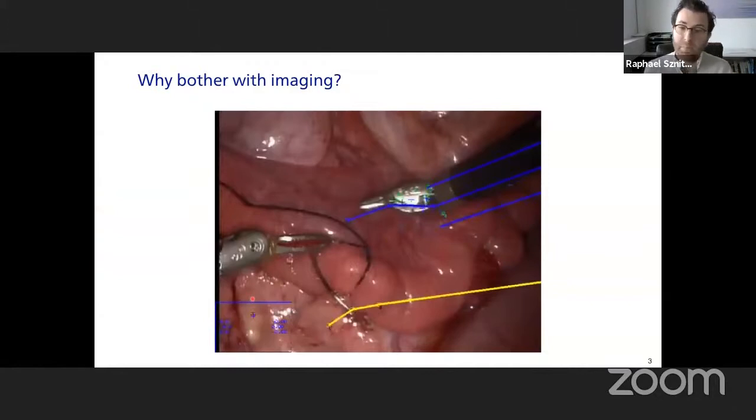That's why computer vision methods for analyzing video content have gathered quite an interest in the last few years, and now there's a regular international challenge for detection and segmentation of instruments in this surgical environment.